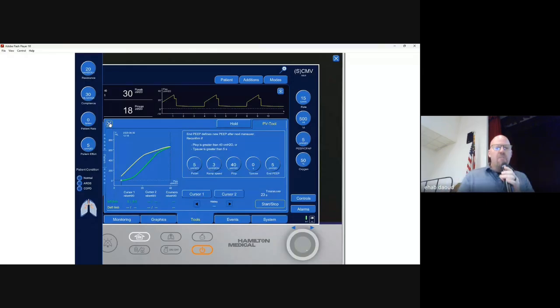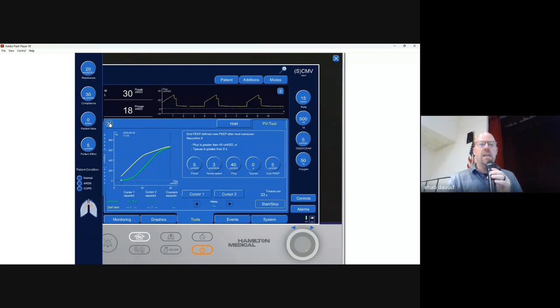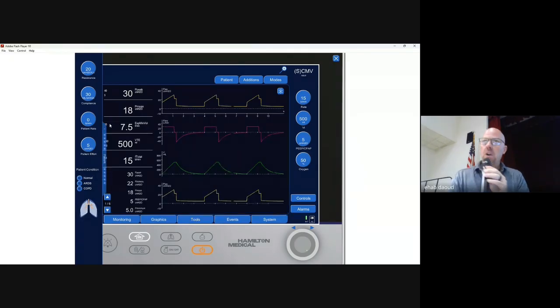Okay, look, to wrap this up too, when you're teaching with the device, depending on the test lung you have, we talk about the different mechanics. You may think in your head as you're presenting, I want to show a compliance of this and resistance of this, but there's also presets. So if you look at this particular simulator, there's a couple of additional functions that are very difficult to show while you are training on a device.